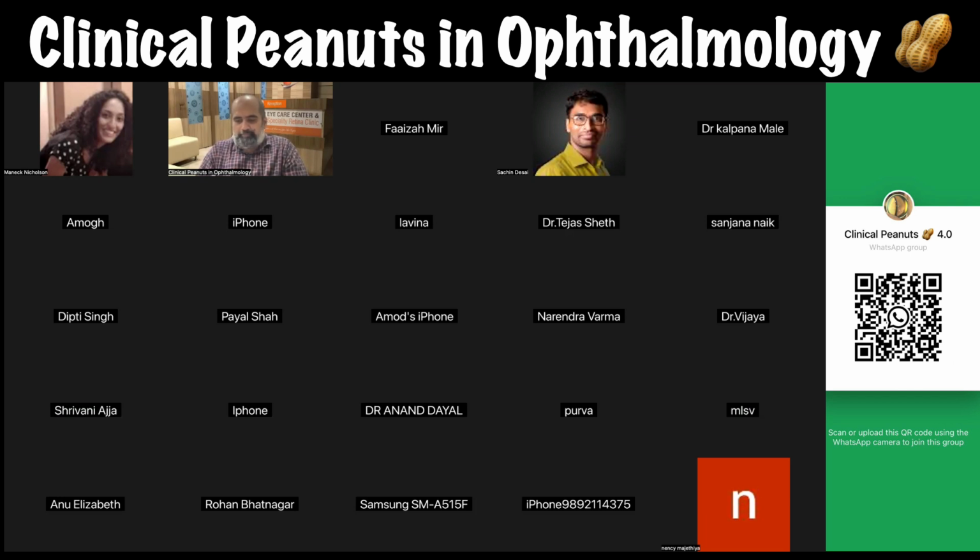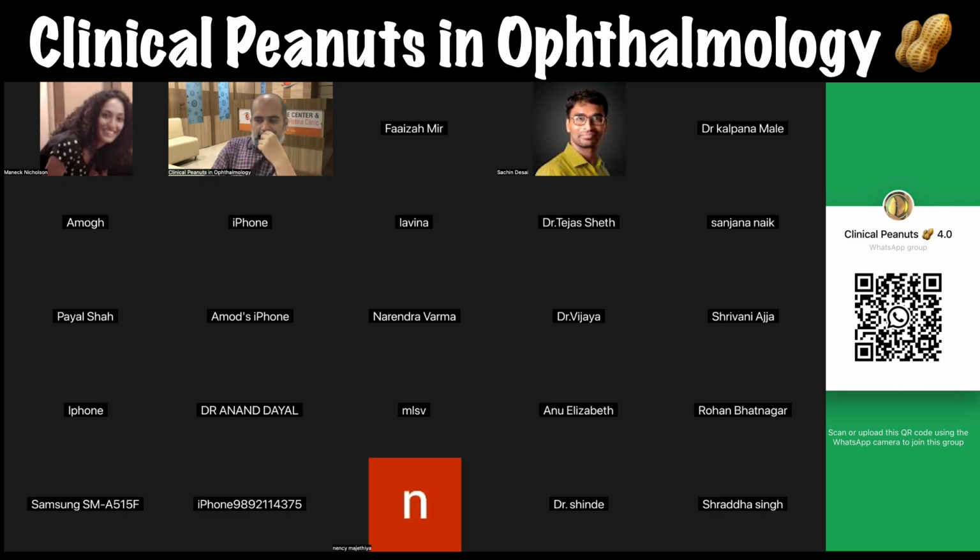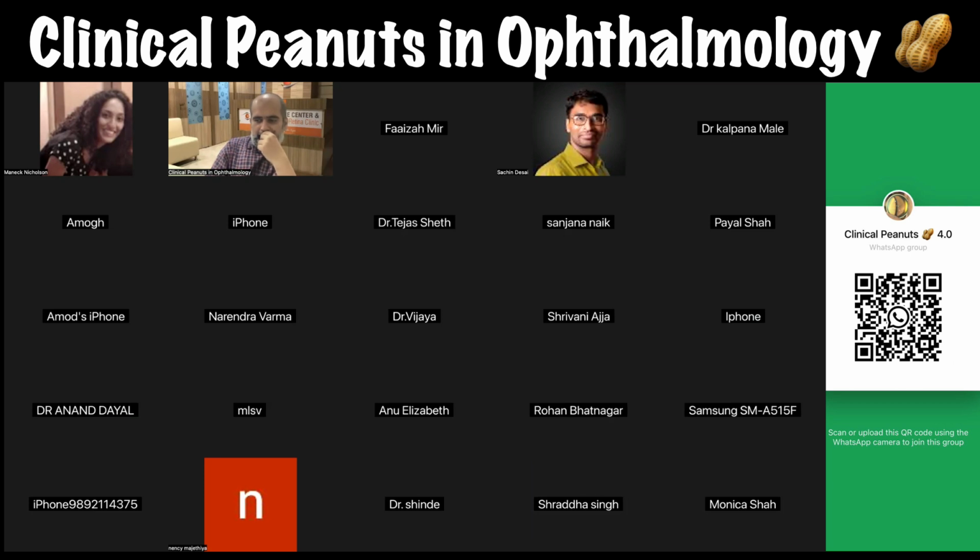So in Bombay, if you're starting out and the cataract is not very hard, I would just say call one of those biometers on rent. They're all optical biometers and give you very good, reliable results. You know what I'm talking about? Yeah. So you mean the IOL Master 700 also can be arranged on rent? I don't think they have the 700, but they have, I don't know if it's the 500, one optical biometer which is quite good. So I would still consider using that versus just say an auto ref, which might be my last option. If you can get that and feed in those values on the Barrett calculator, that should be good enough in the beginning.